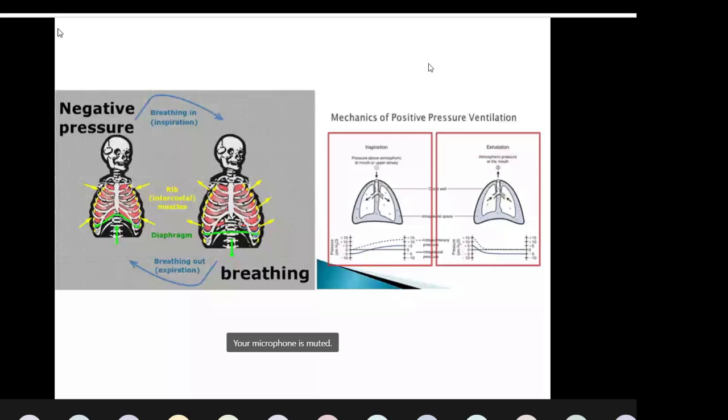So as Vineeth has told, COVID ARDS is predominantly a type 1 respiratory failure. So oxygenation is what is defective there, and improvement of oxygenation is what improves that. The improvement of oxygenation, as he has rightly told, is by improving the FiO2. So when you use ventilator support, you can increase FiO2 up to 100%. Next, as he told, is increasing pressure.